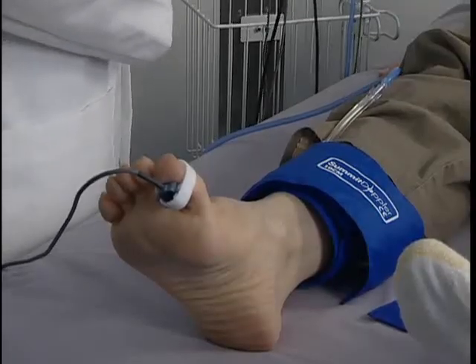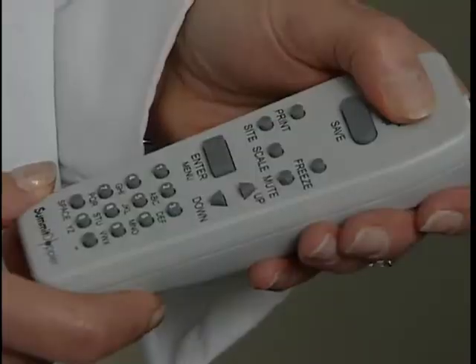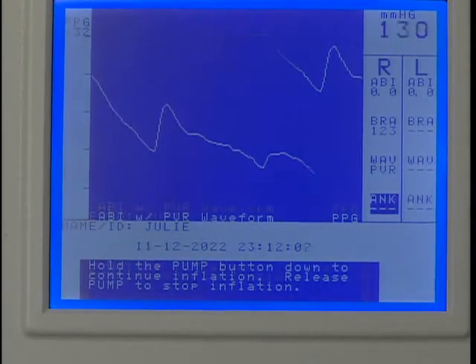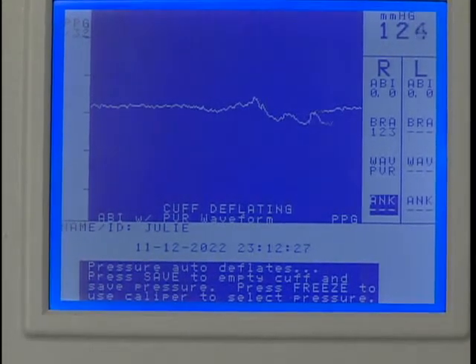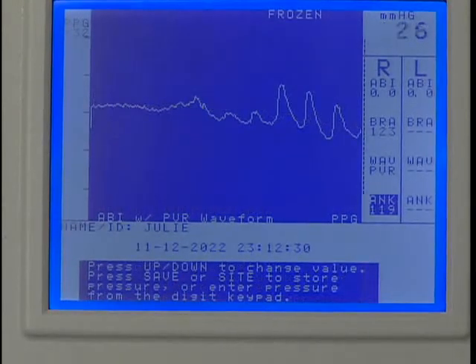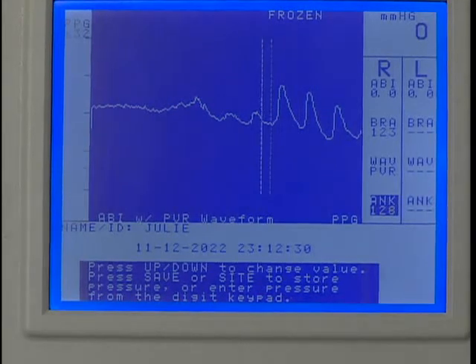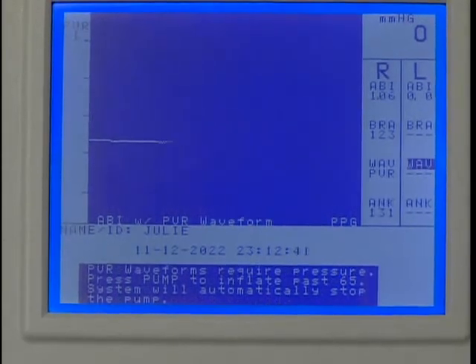Next, we'll obtain the ankle pressure using the PPG probe. Press and hold PUMP to inflate the cuff until the PPG pulsations disappear. Release PUMP and the cuff will begin to deflate. After several pulses have reappeared, press FREEZE and use the UP or DOWN key to move the caliper to the first upward slope. Press SAVE to record the systolic pressure and the marker will move to the next protocol location.